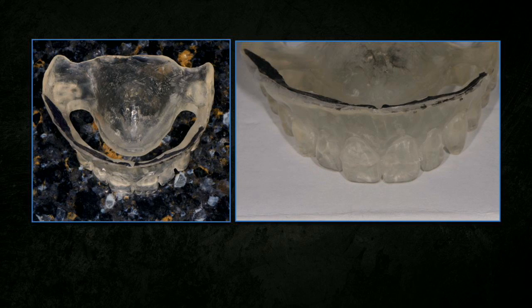So the surgeon could flap the tissue, place this in, and then scribe on the bone where he was going to level.